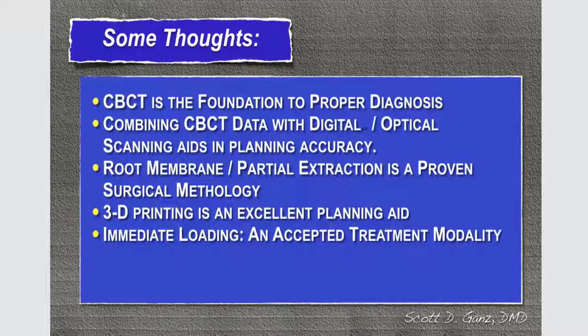Immediate loading is absolutely an accepted treatment modality. We're doing this on a regular basis. I've been doing immediate extraction, immediate placement since 1989, and immediate loading is about 85% to 90% of what I do with implant dentistry on a daily basis. And so it is here to stay, and of course it is an important part of our ability to treat our patients better, because obviously patients really want to get ahead in terms of time, and some of these procedures obviously have taken a long time to complete with implant restoration.